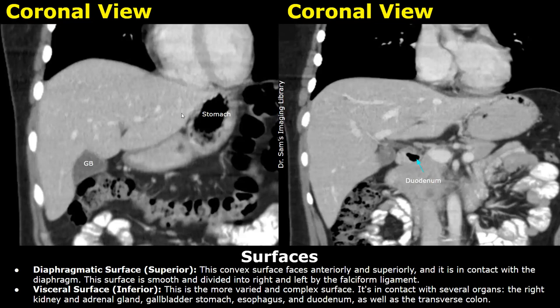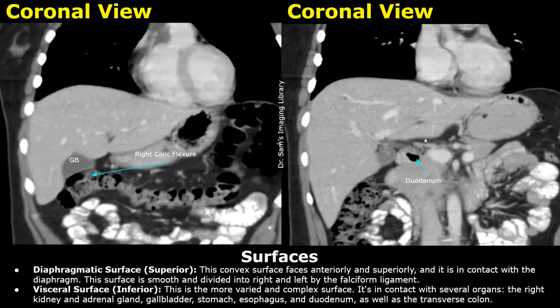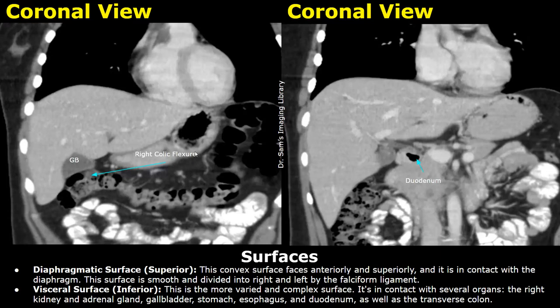This fluid-filled structure is the gallbladder. In this image you can see that the liver is also in contact with the duodenum right here at this point. A small margin of the liver is also in contact with the transverse colon. Here is the right colic flexure, also known as the hepatic flexure — it consists of a curve at the junction with the transverse colon. So you can see that the visceral surface of the liver is complex.